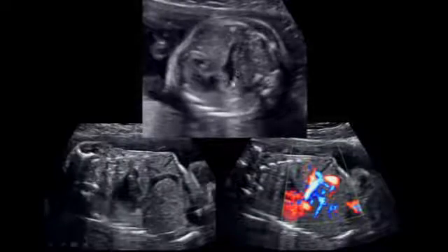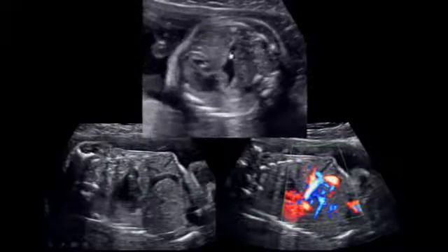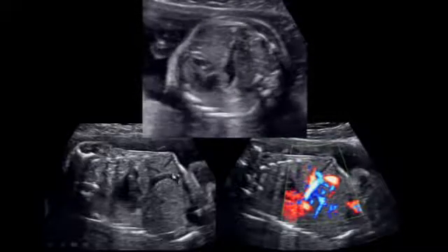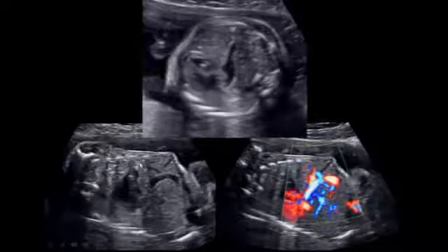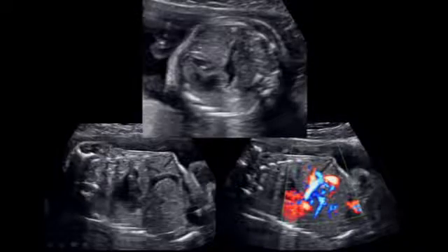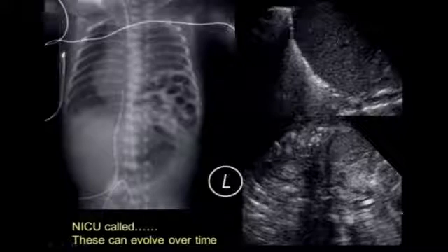Another diaphragmatic hernia, you can see the stomach is a little bit flattened, there's bowel loops in the back, and there is probably a piece of liver in the front. What do we do? We look for the portal vein turning and coming across the diaphragm. And on the color Doppler here, power Doppler, you can see a branch of the portal vein crossing the hole. Here's a little piece of the diaphragm. Here's the herniated liver going through, and the color power Doppler helps confirm that liver being above the diaphragm.